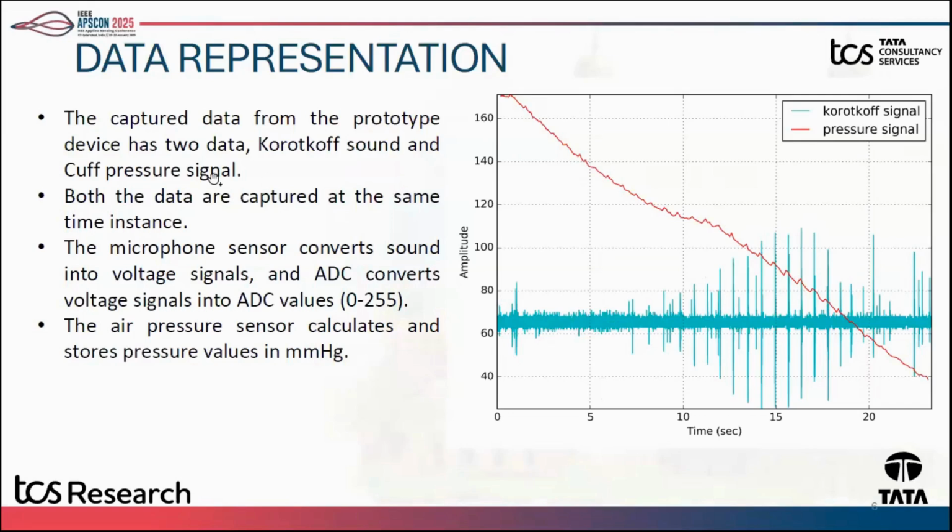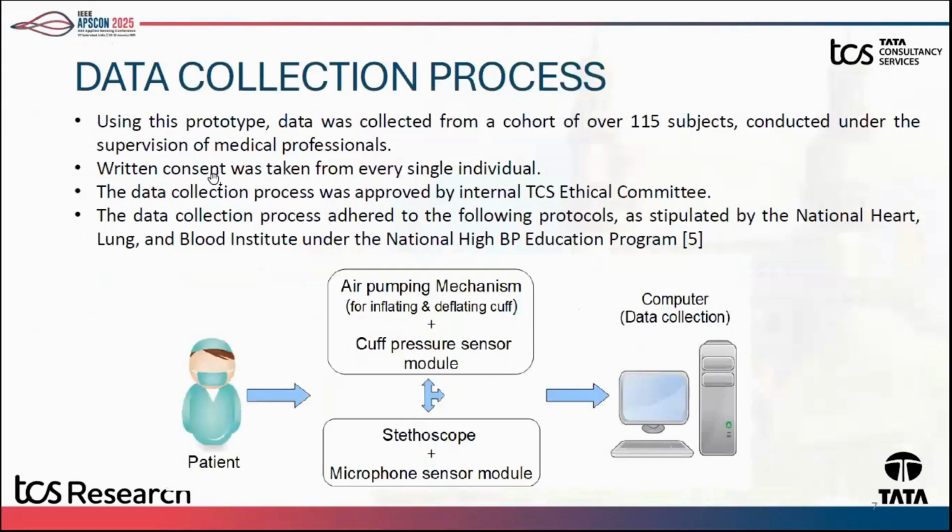And to validate this process, we collected data from 115 subjects under the supervision of medical professionals, who are also co-authors of this paper. Written consent was taken from every single individual. Also, this data collection process was approved by the TCS Internal Ethical Committee. All the protocols were followed, and the collection process also followed the protocols mentioned under the National High BP Education Program. So we took 4 samples from each subject.